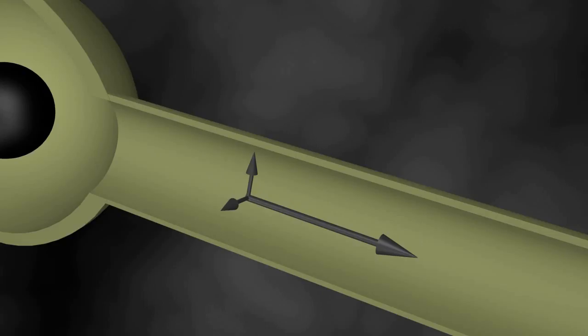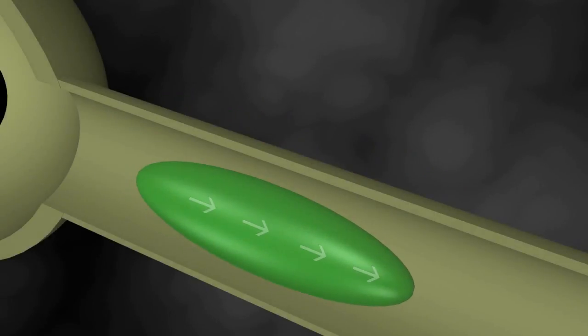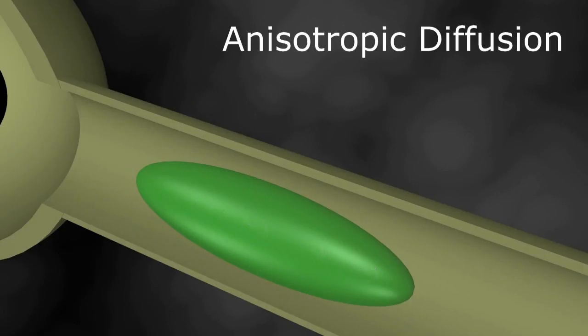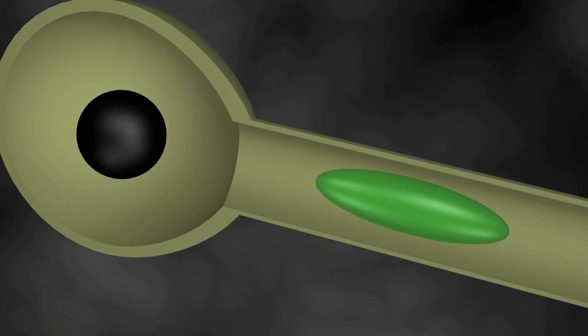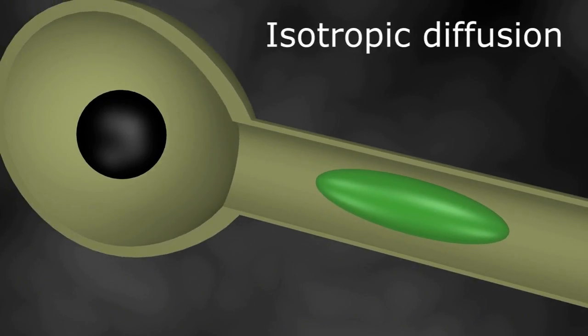Couple more things before we wrap this up. First of all, if we take our tensor eigenvectors and rotate them on the main axis of the large vector, you can see the path maps out an ellipsoid. The long axis of the ellipsoid graphically depicts the main direction and relative rate of anisotropic diffusion, with the short axis depicting the minor direction of diffusion. Contrast that to the tensor ellipsoid representation of isotropic diffusion in the cell body.